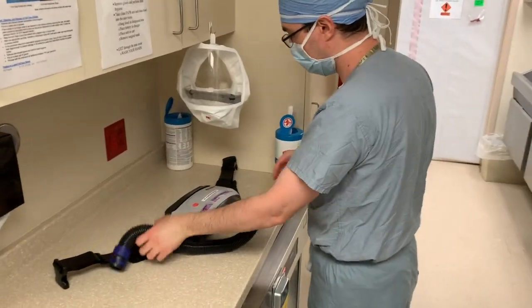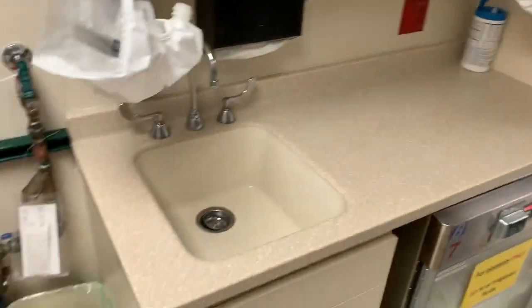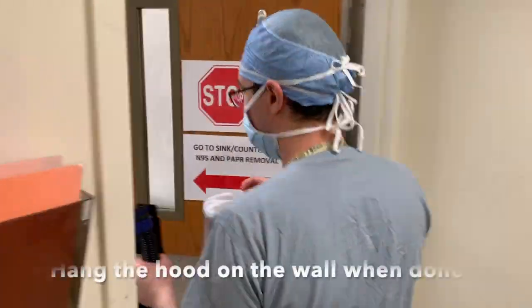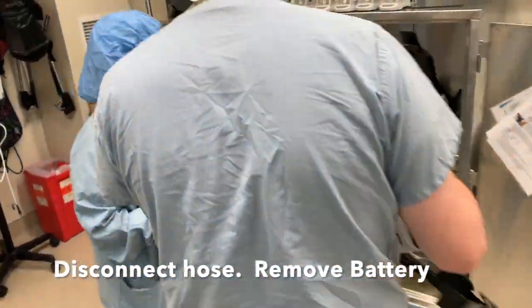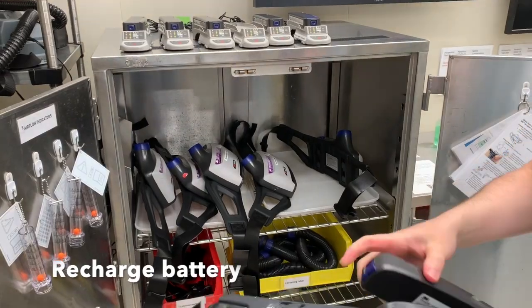Once you have done this, you can take the power pack carefully and the hood and go back into the anteroom. You are then going to hang the hood on the wall. You are going to put away the pack and the battery and make sure you recharge the battery, which can last about 8 hours of functioning.